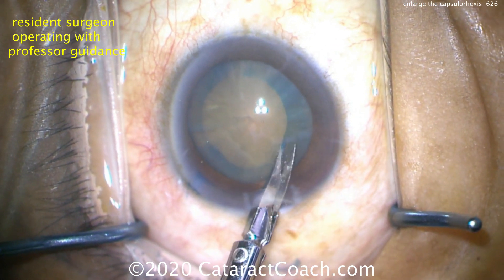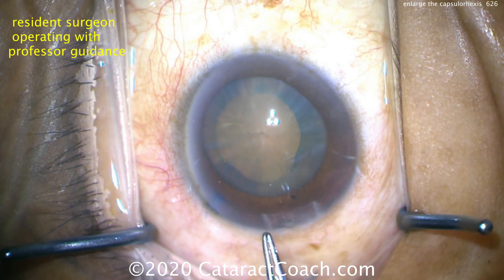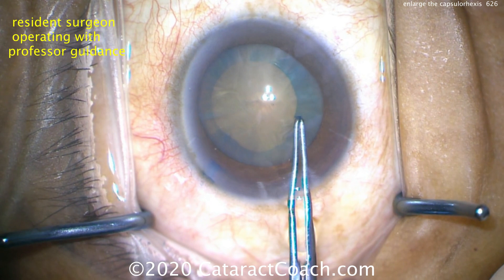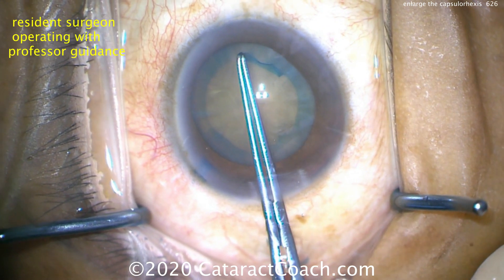So we'll use the small scissors here to create a little snip at that tangential angle right at the capsular rim. Now using the same capsorhexis forceps, I'm going to grab that and tear off an extra strip here, and we'll still have a nice, round, intact, strong capsorhexis.